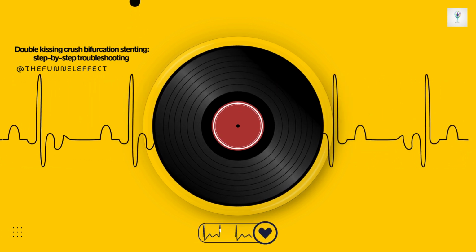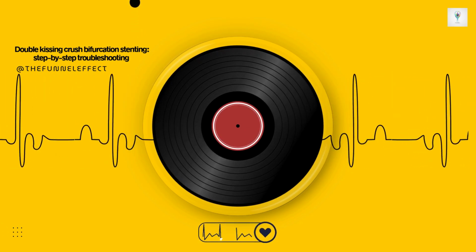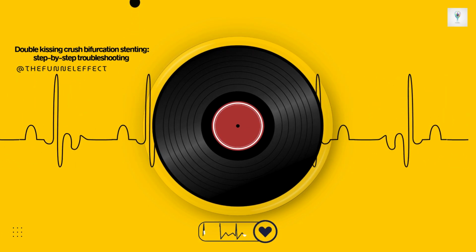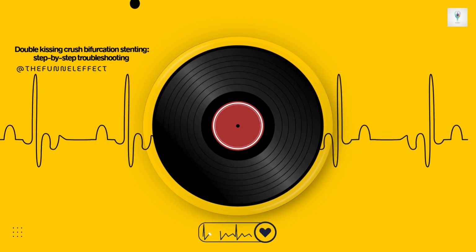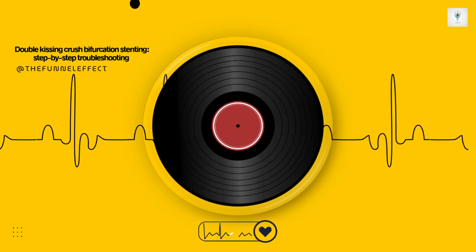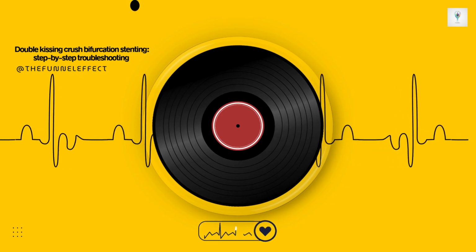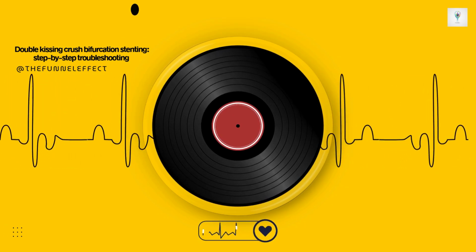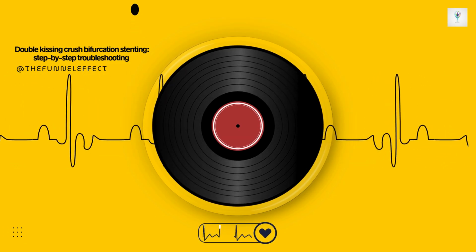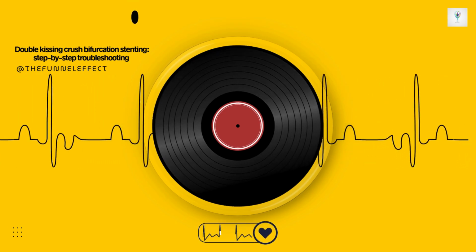Okay, polymer jacketed wire it is. But what if, even with the right wire, it gets stuck? You can't pull it out after the crush. That sounds like a nightmare scenario. It is a potential nightmare. And the absolute number one rule is, do not yank forcefully on a trapped wire. You risk breaking it, leaving a fragment behind. That often means calling the surgeons for emergency retrieval. The recommended rescue maneuver, counterintuitive as it sounds, is to try and advance something over the trapped wire. Usually a small balloon or a microcatheter.